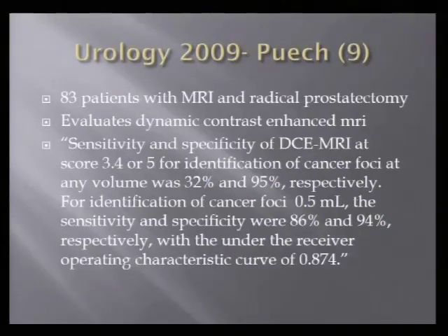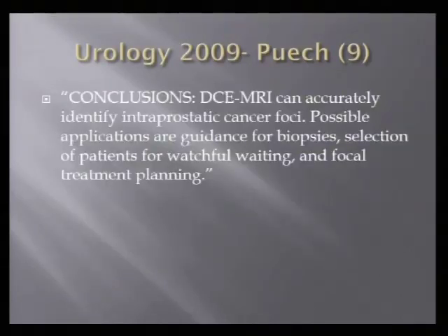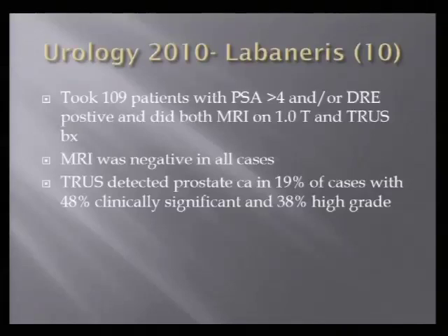And so here's just a review of dynamic contrast MRI. I'm just going to go to the conclusion. It can accurately identify intraprostatic cancer foci, with possible applications for guidance of biopsies, selection of patients for watchful waiting, and focal treatment planning. Another one with MRI and biopsies. This is actually a negative one for MRI that I agree with.